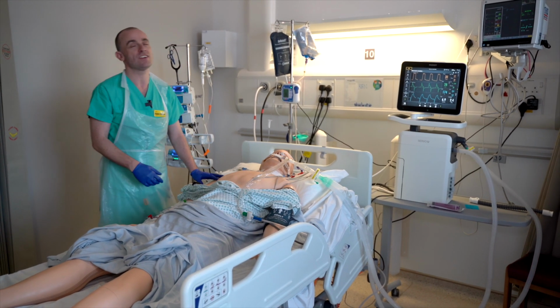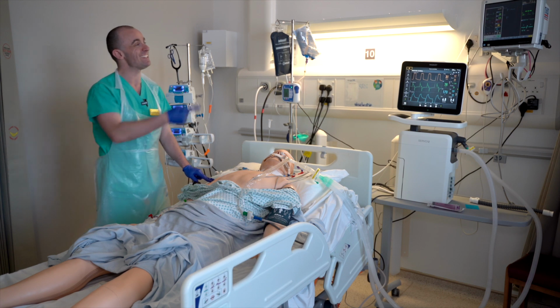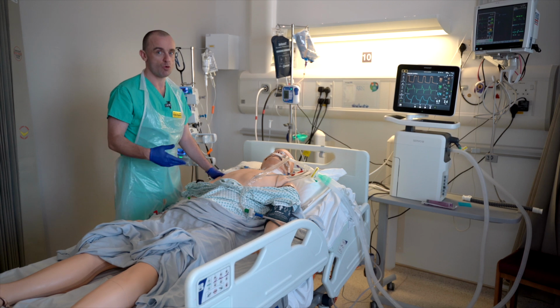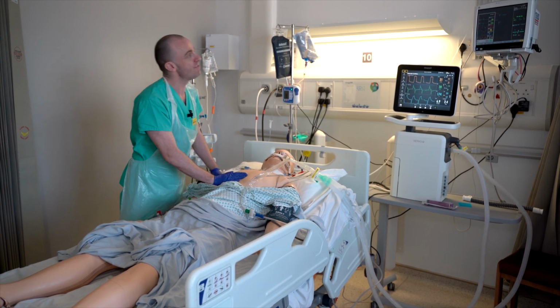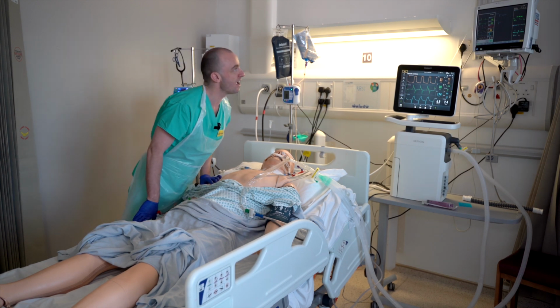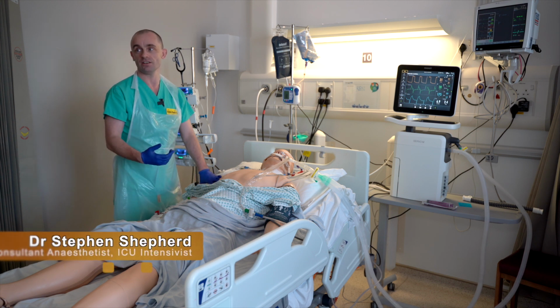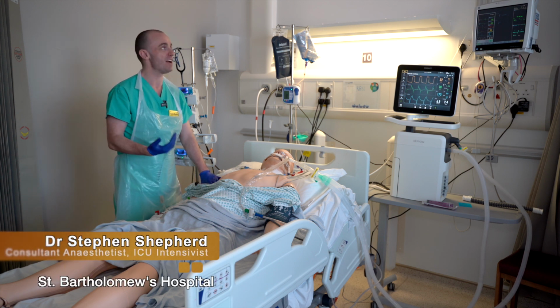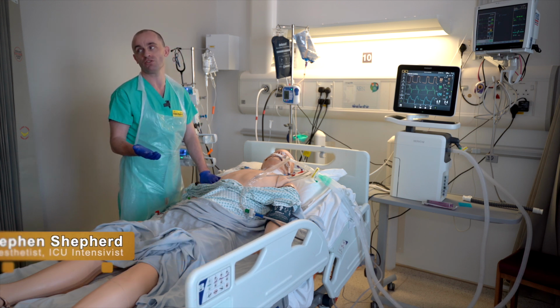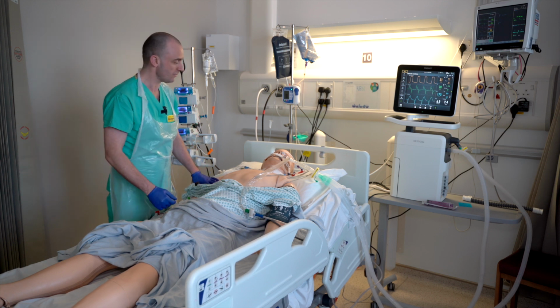and patients on intensive care will have usually continuous ECG monitoring, and I can see there I've got a heart rate of 48. That seems quite slow, but actually normal is not normal in intensive care. And if I look at the red line below, which is an invasive arterial line, I can see that I have a blood pressure of around 120 on 50. So actually I've got a good blood pressure despite being a little bit slow, which may be because of sedation or maybe because of administration of other medication. I'll be able to get a better sense of that as I continue on.